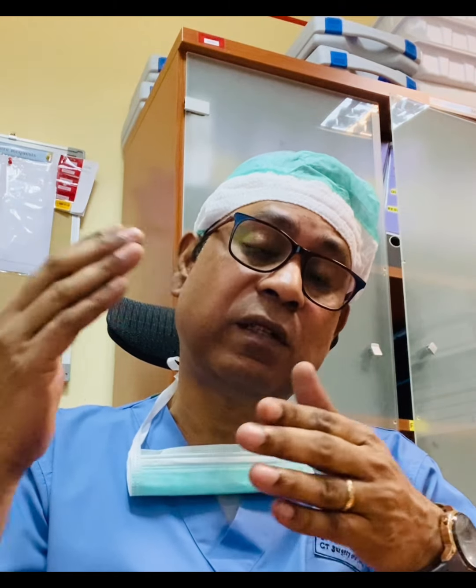The reason can be that your pump speed is higher than the patient requires. Cannula position can be the reason, if both cannulas are near to each other. Low cardiac output can be the reason, or increased intra-abdominal pressure can be the reason for your recirculation. So these are the reasons for recirculation.